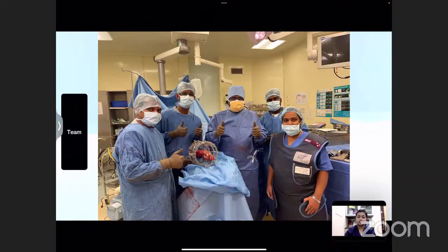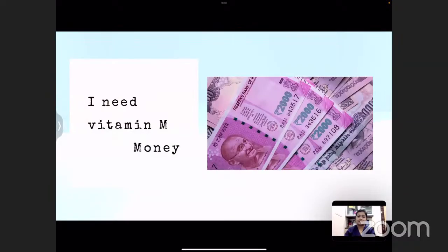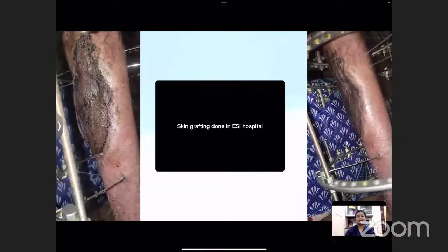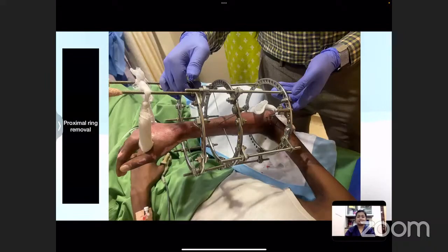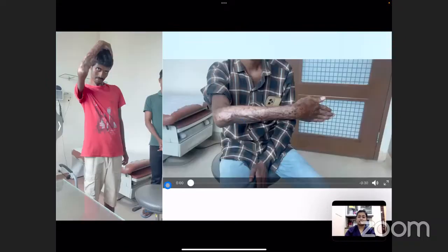You can see with the vac, the wound is beautifully healed, and then he disappeared completely because of vitamin M deficiency. So that company never supported him. So he disappeared and went to ESI hospital to get a skin grafting, successfully skin grafting done. Wound healed very well, and he came to me again. I removed the proximal ring and manipulated, and he started going to physiotherapy. This is after removing the ring. I removed the ring also, and I manipulated his elbow, and you can see this now. He came recently.